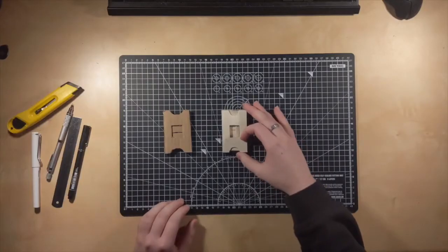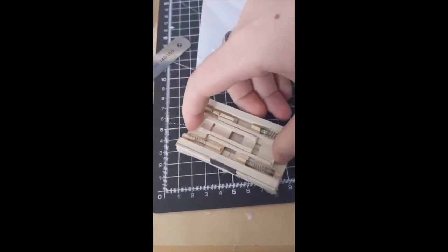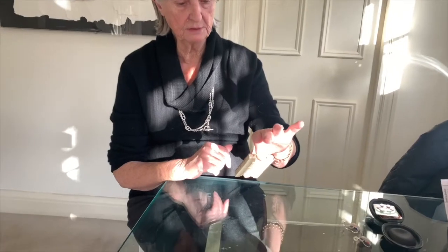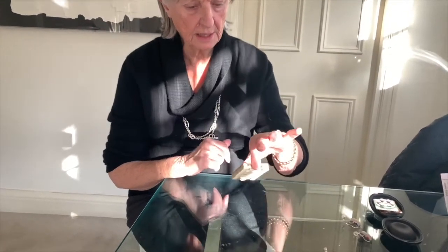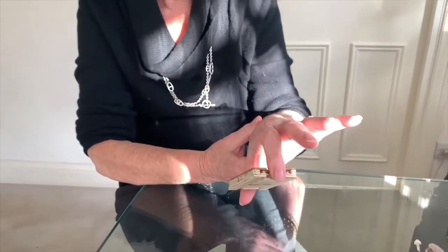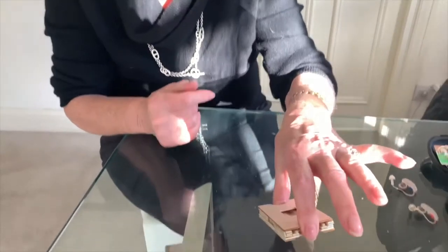We then improved the designs, making working prototypes out of balsa wood and stronger materials. It's a bit rough from the edges, so the idea is quite clever. It's a bit pokey, but no, the principle is quite good. The only thing is it doesn't seem quite strong enough to hold the battery.